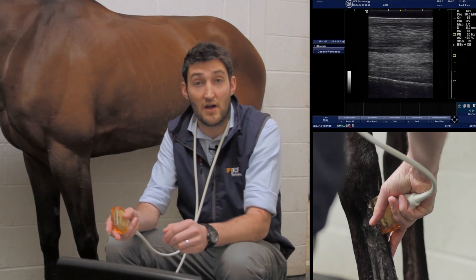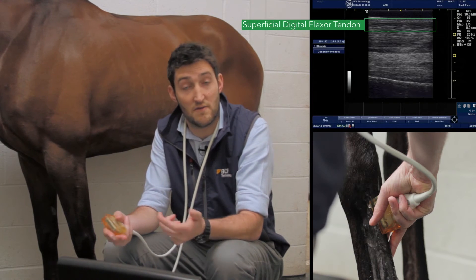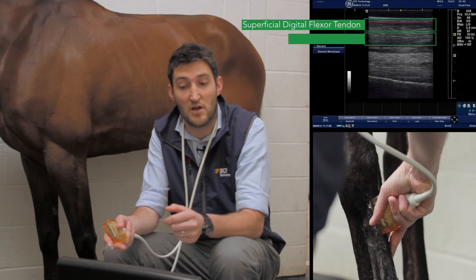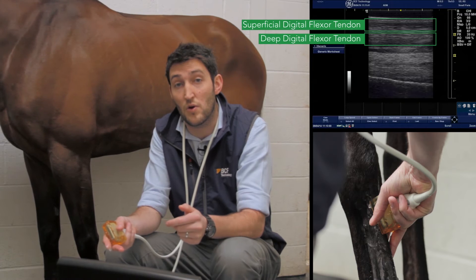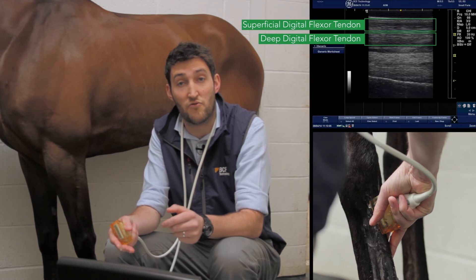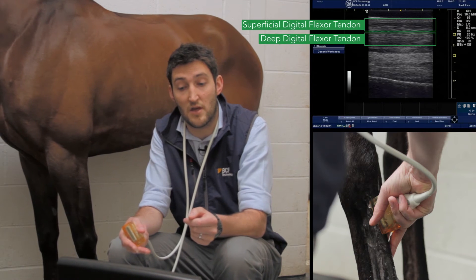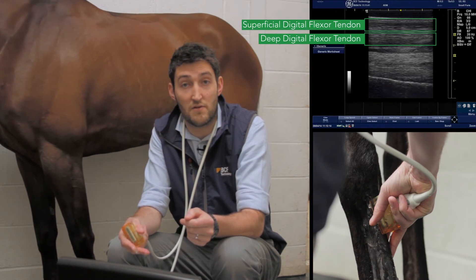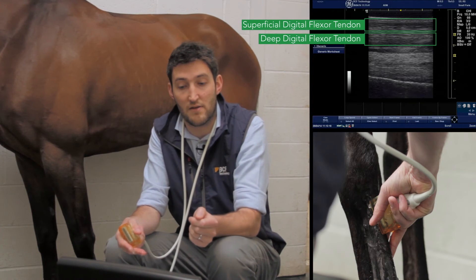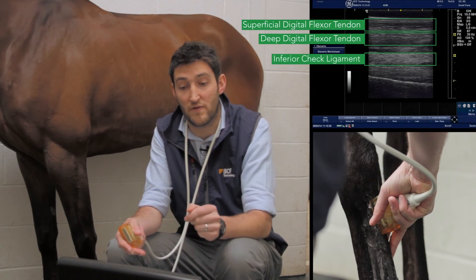So looking at that picture now: at the top we have the superficial digital flexor tendon — that's exactly the same as on our transverse images — and then immediately below that we've got the deep digital flexor tendon. It can actually be quite difficult to separate those two in this longitudinal view; their borders can be a little bit less distinct than on the transverse section. Then we've got a little bit of fluid, as we had in the carpal sheath, as a distinct separation between the dorsal border of the deep digital flexor tendon and then into the inferior check ligament, or accessory ligament, of the deep digital flexor tendon.